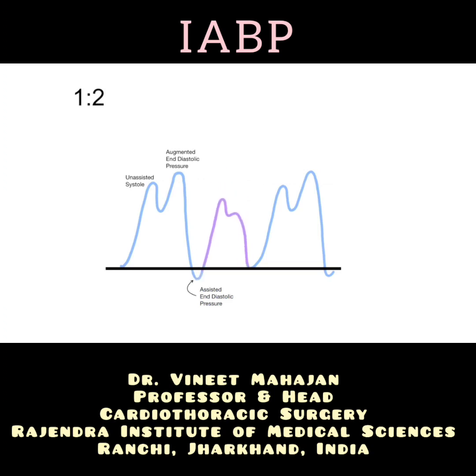Let's look at the next heartbeat. Notice how the systolic pressure in the second heartbeat is lower than the systolic pressure in the first heartbeat. This is because we started heartbeat number 2 systole at a lower end diastolic pressure from the previous beat. Because the intra-aortic balloon pump assisted in making the pressure lower, we call this the assisted systole, not to be confused with the unassisted systole.